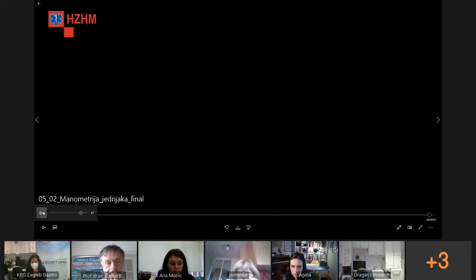Evo ga. Zahvaljujem Maši našoj koja je napravila manometriju. Mašo, imaš možda nešto nama za reći što je najteže u izvođenju manometrije tehnički? Pa, ponekad, posebno kod bolesnika s ahalazijom, zna biti teško naprosto proći donji sfinkter. Mi smo već nešto pričali, ali uglavnom to uspijemo. Nismo do sada koristili endoskopiju kako bismo si pomogli. Mislim da je to zgodna ideja za odsad nadalje, kako bismo bili uspješniji u pozicioniranju katetera kod takvih pacijenata.